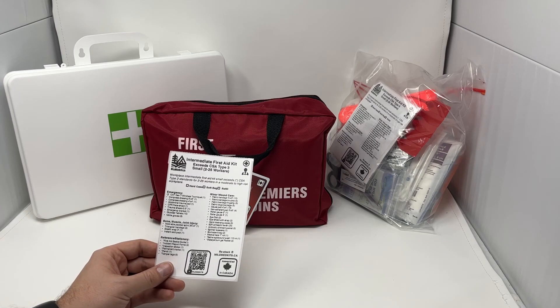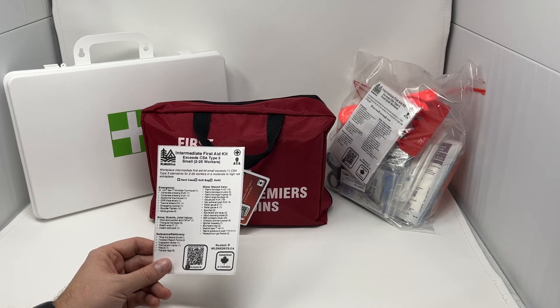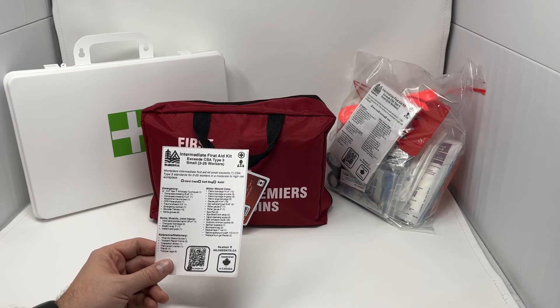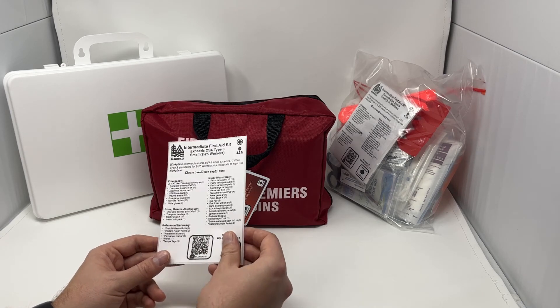This is the most robust Workplace First Aid Kit, and this level of kit is really designed for workplaces with a higher likelihood of traumatic injury or further distance from EMS. Some good examples would be mechanic shops, arborists, manufacturing, summer camps — anywhere where there is a higher probability of a traumatic injury or a potentially longer response time by EMS.